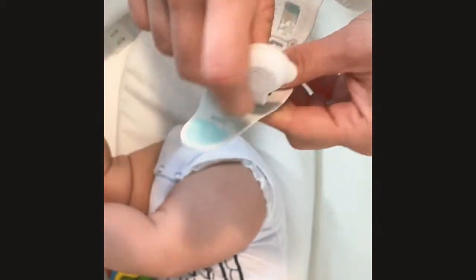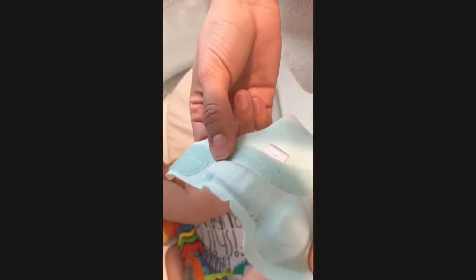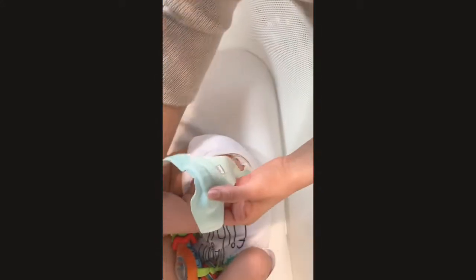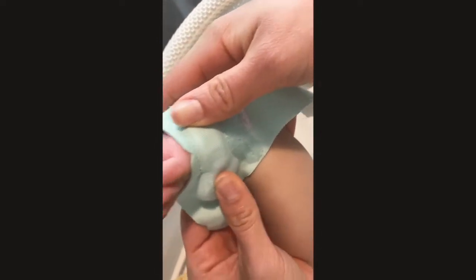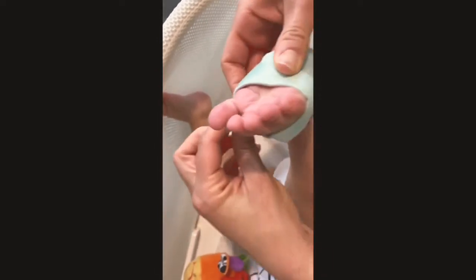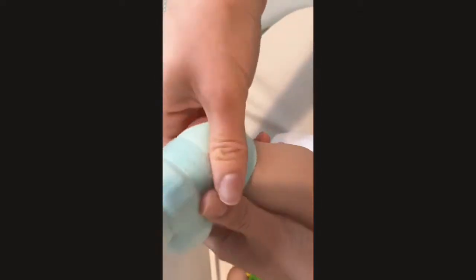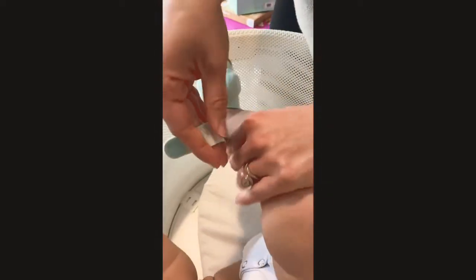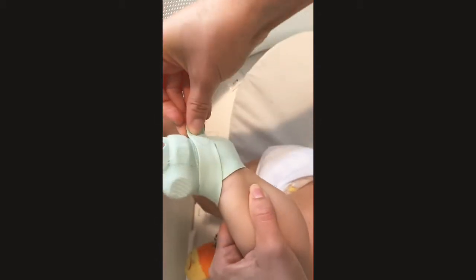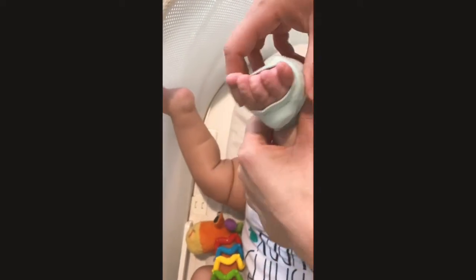This flips into here. It fits in there like that. That's a little sensor that's going to go on his foot. The little cutout here — that's what's going to go on the side of his foot, and that's how you know you have the right placement. You want that little cutout right on the side of his toe. Then this wraps around the back and over to the Velcro. That's how your sock should fit, and that's why the sensor is hitting right there on the side of his foot.